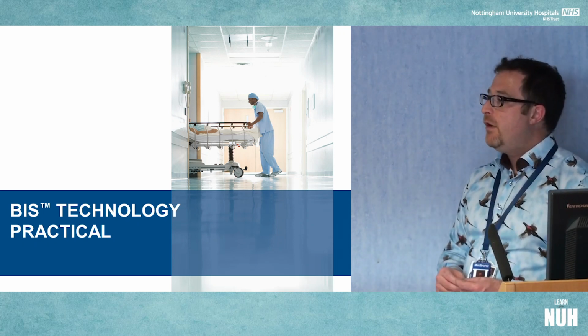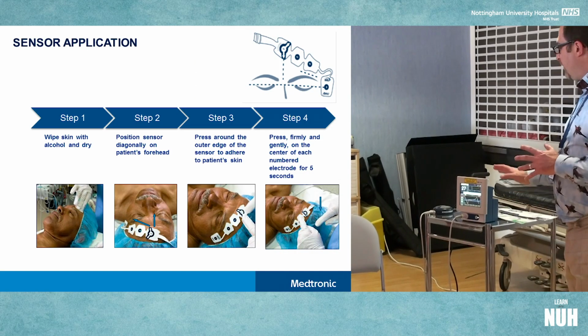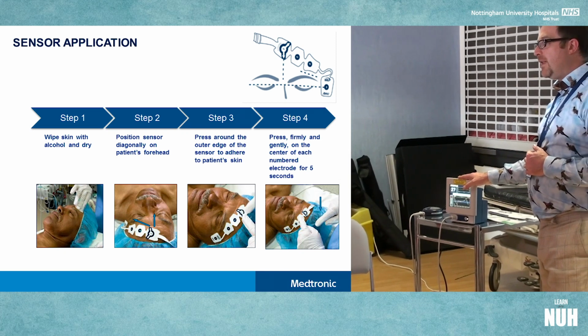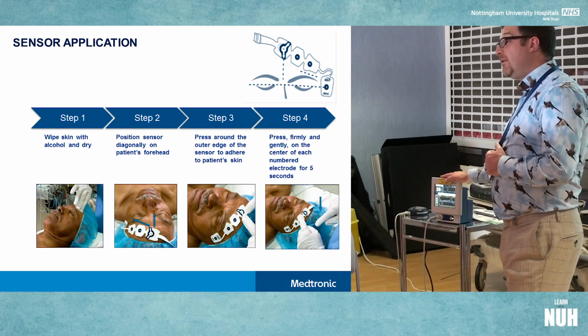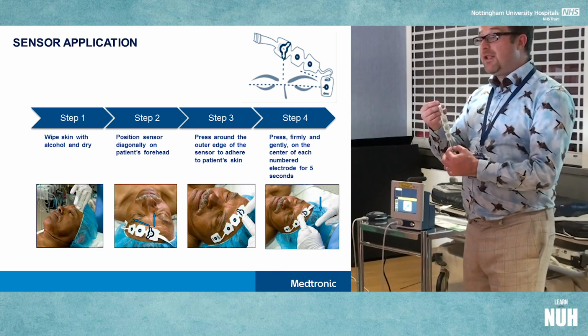Okay, so we'll move on to the practical session now. So, BIS monitor, we're going to run over the BIS monitor. And what I'll ask for now is a volunteer. Can I have a volunteer up? Pull the BIS sensor straight off.